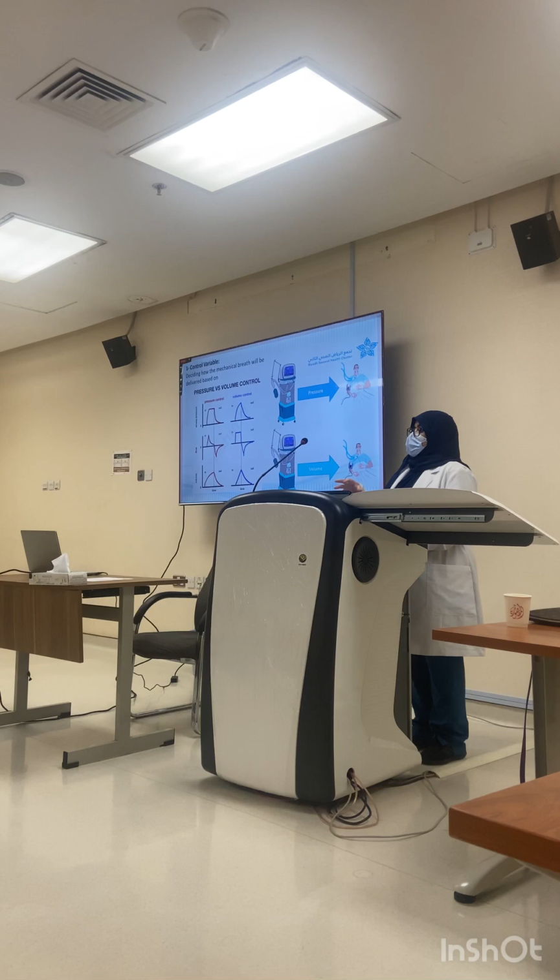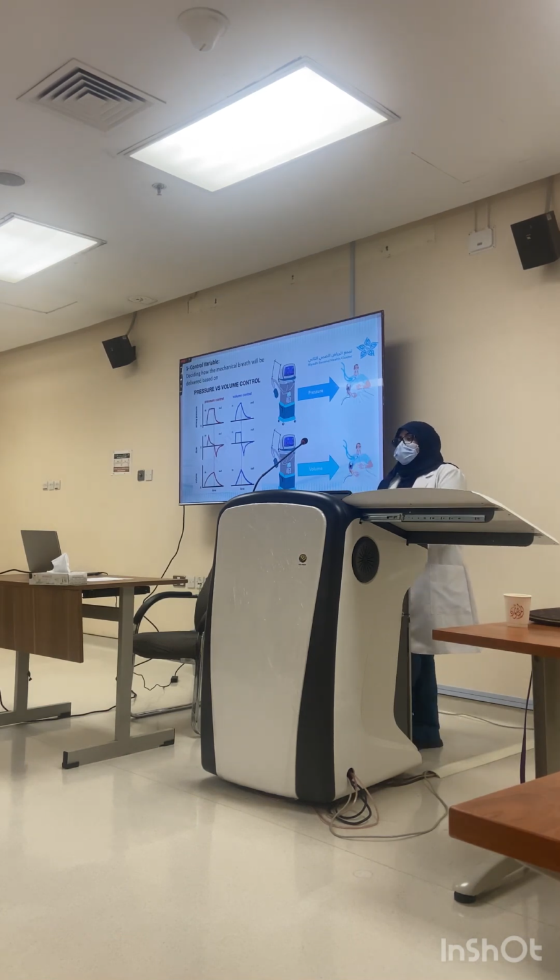So let's say we are using a mode that's controlling pressure. That means I am controlling the mechanical breath delivery by controlling the amount of pressure that's delivering the volume. If I'm using a mode that controls volume, that means I'm delivering the mechanical breath based on an amount of volume delivered to the patient.